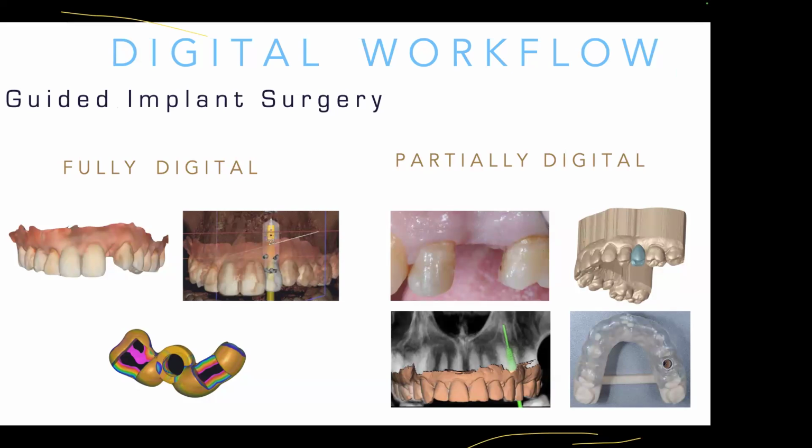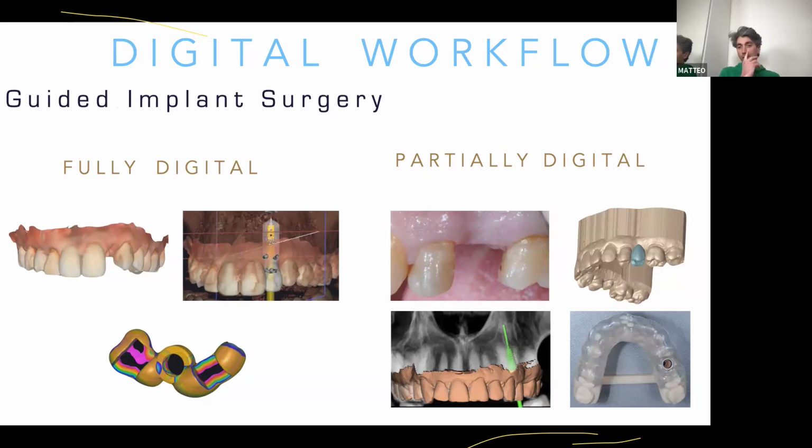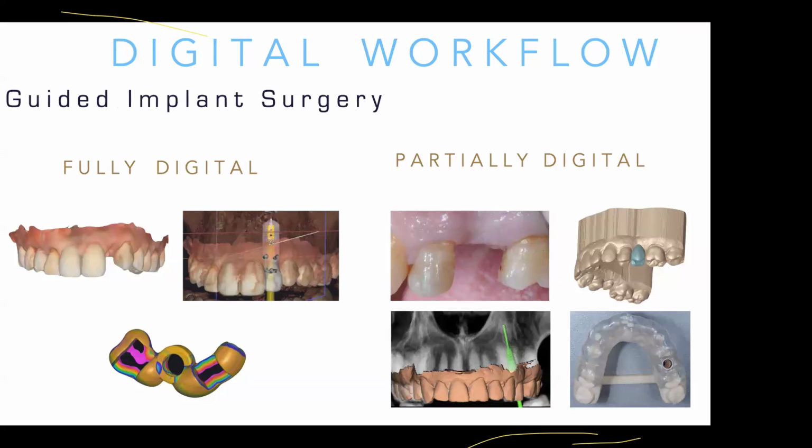And for the partially digital protocol, we can take an impression and then have a model cast, and then we can do the digitalization of the model cast in the laboratory.